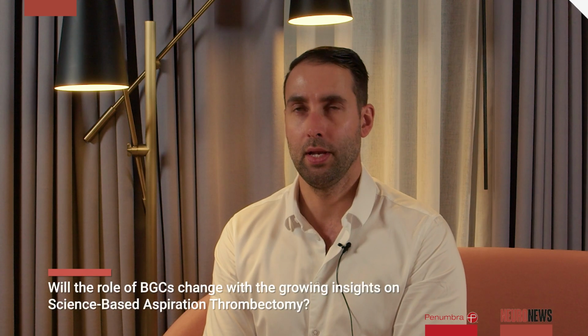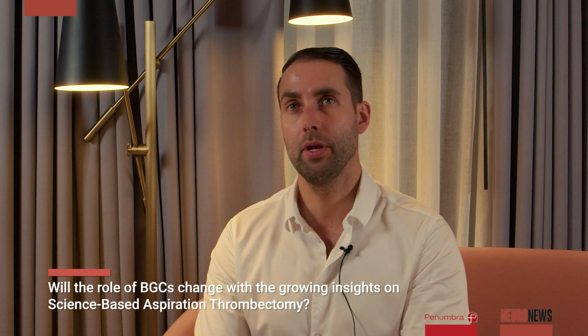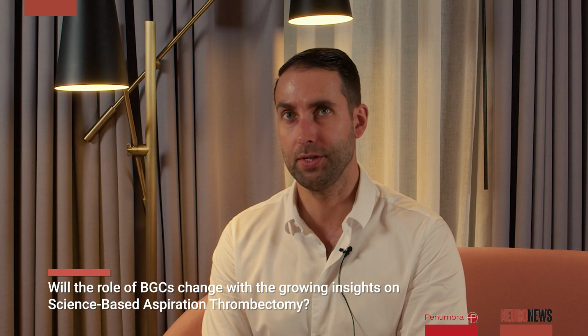I believe fewer and fewer people are starting to use balloon guides because people are starting to understand better the true physics of aspiration. Before, people just thought of aspiration as a pull effect of the pump, but now they understand that it's actually much more than that. The systolic pressure that you have also really helps push in the clot.